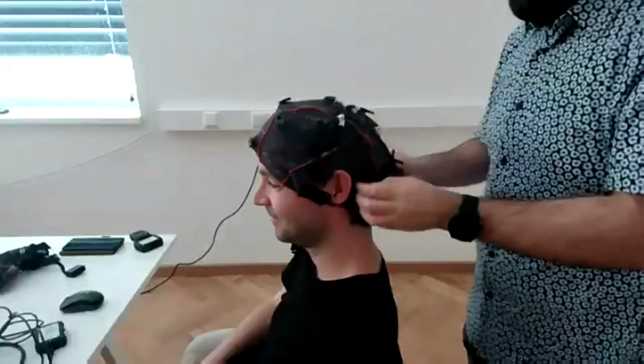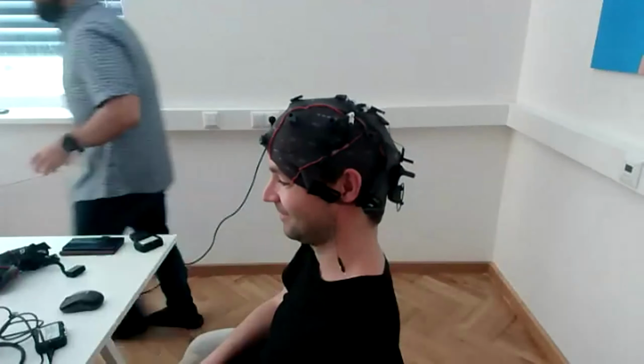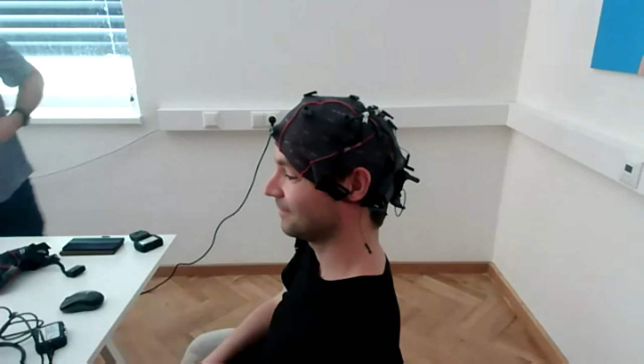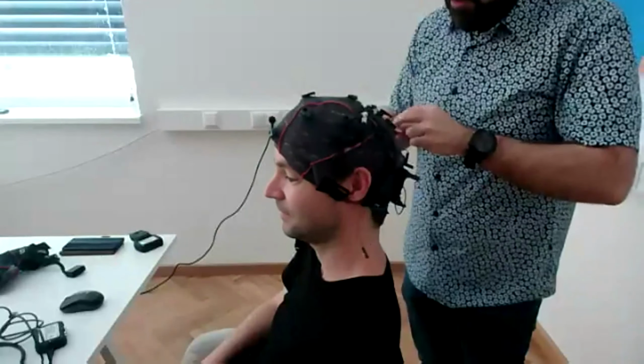Then I will just roll around because Matthias has a bit more hair than me so far. And we will use 2 stickers, which are here. Okay, thank you. 2 stickers for reference and ground. So a bit something like the Unicorn.